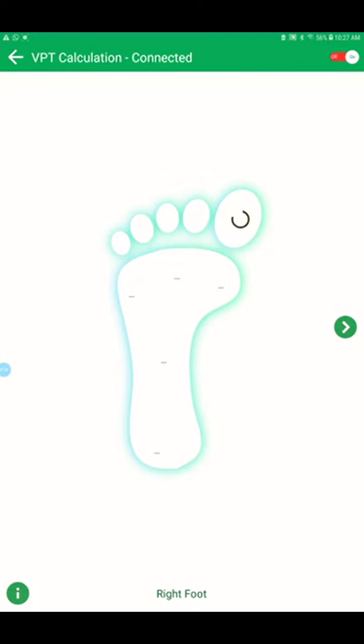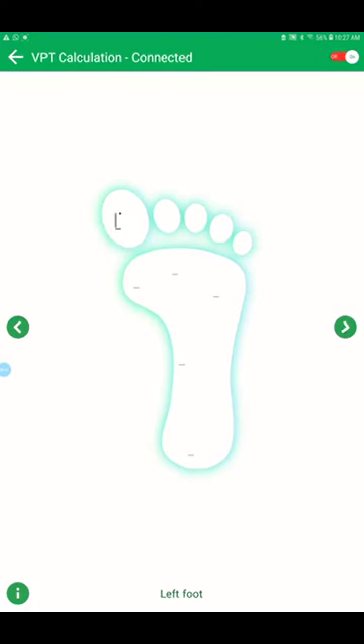So now I just increase or decrease the voltage and put it on the patient's leg and find out what vibration he is feeling, and then once everything is correct, I record it on the device. So the moment it records, the number comes to the foot. Like that I am doing it for all the feet. Okay, now for the other foot I will make it, let's say, 19. Okay, so just for demonstration I am using the same value and recording.